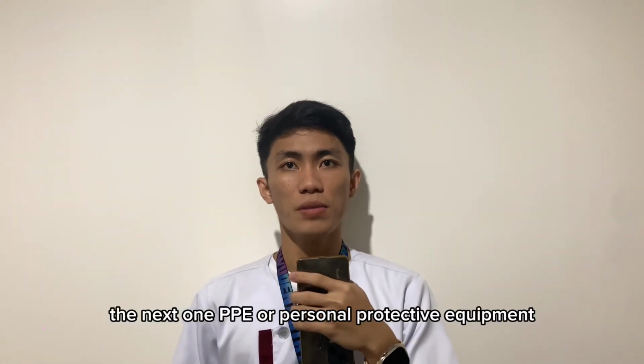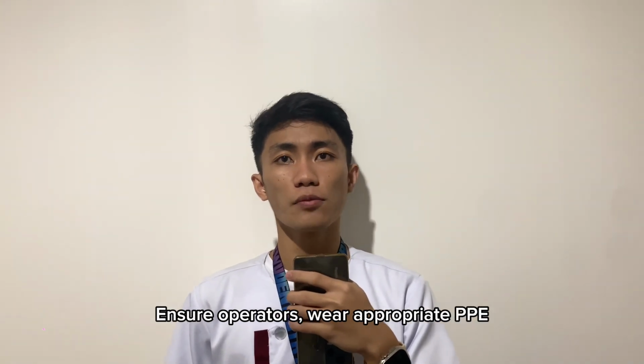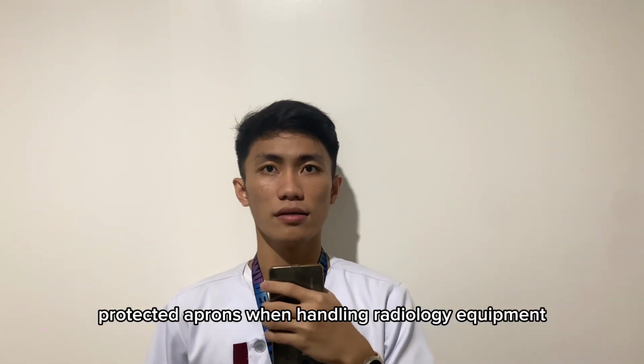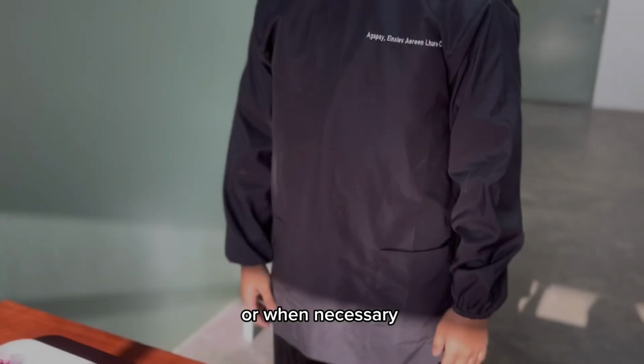The next one, PPE or personal protective equipment. Ensure operators wear appropriate PPE such as disposable gloves and protective aprons when handling radiology equipment. PPE should be changed between patients or when necessary.